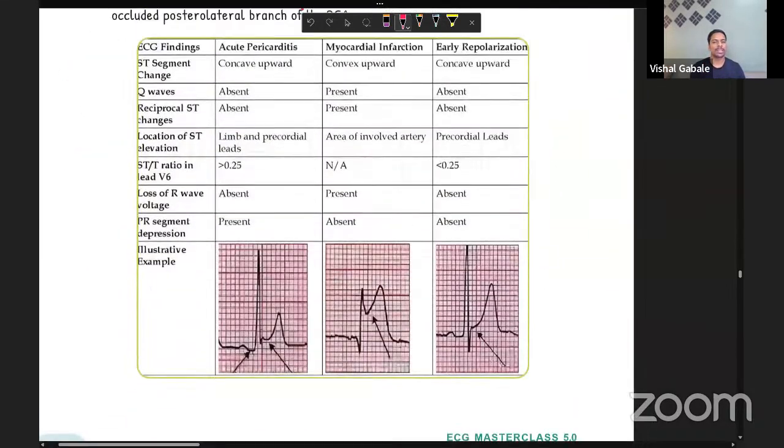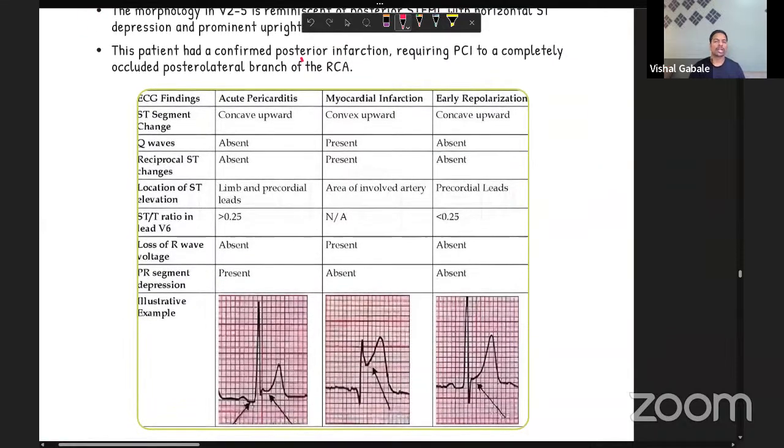Okay. Finally, coming to the conclusion of myocardial infarction with the close differential diagnoses like acute pericarditis. So what will happen in acute pericarditis? There will be ST elevation in all leads, right? And there will be no reciprocal changes, isn't it? There are no reciprocal changes here.